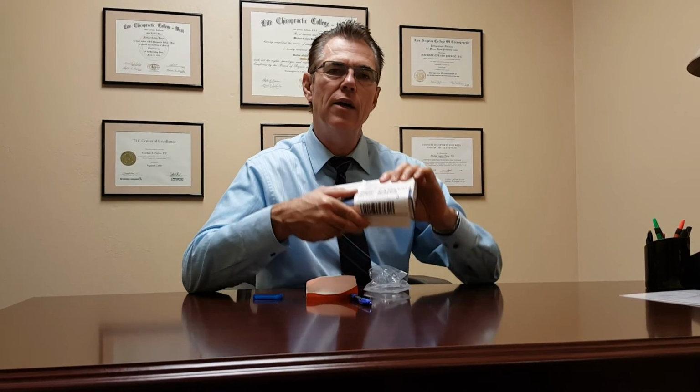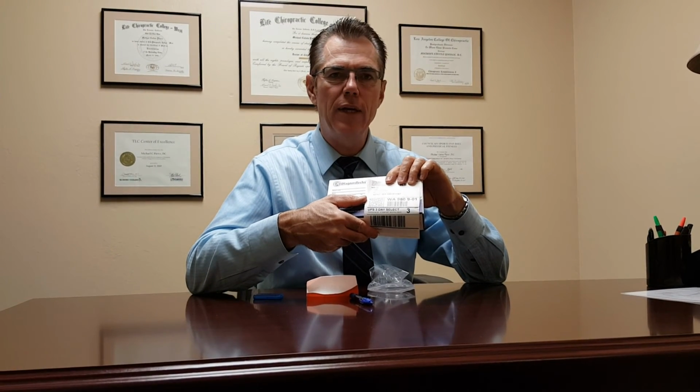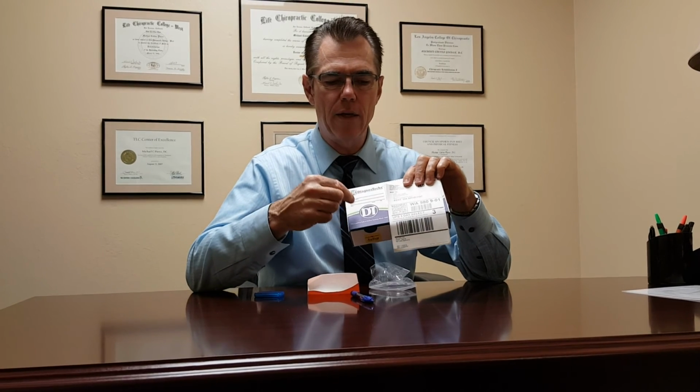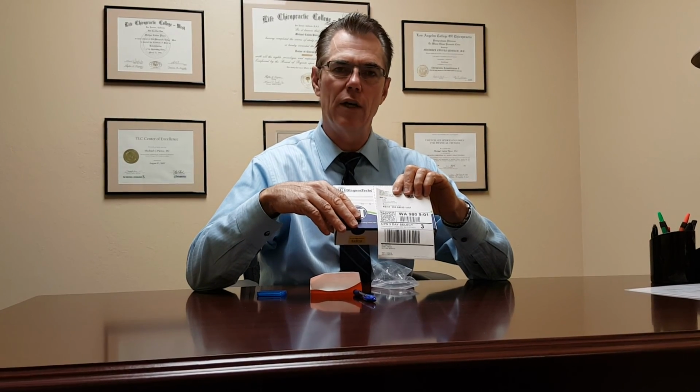This needs to be dropped off at UPS Monday through Wednesday. If you complete the sample on Thursday, again, write the appropriate date, freeze it until Monday, and then send it out then. Again, if you have any questions, you can call our office.